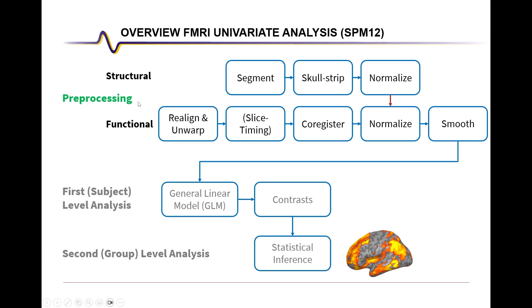Today we will start with pre-processing, which involves pre-processing of both structural and functional images. We use the structural anatomical image of the subject to have high anatomical resolution, to then normalize our functional images via the structural images. Structural pre-processing typically involves segmentation into different tissue types, then skull stripping to end up with an image of the brain, and finally normalizing into standard MNI space.